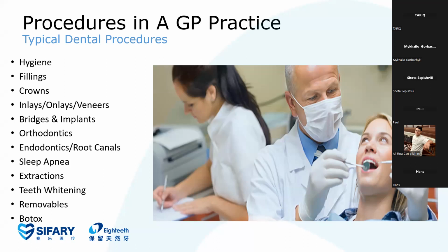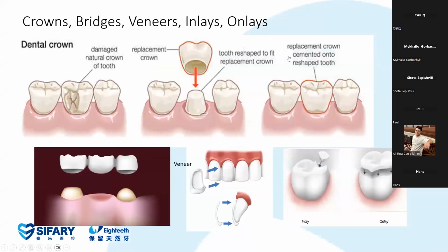Probably you have heard many of them from your friends, or if you are already experienced in the field, you have heard most of them. For intraoral scanners, we will be focusing today on the restorative types, which doctors mostly use as a treatment option. It could be crowns, bridges, veneers, inlays, and onlays.